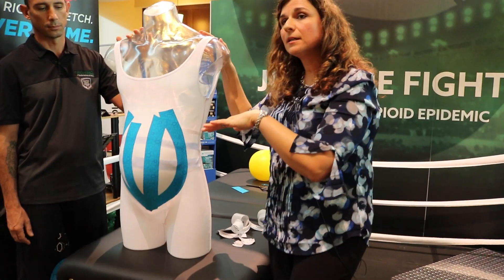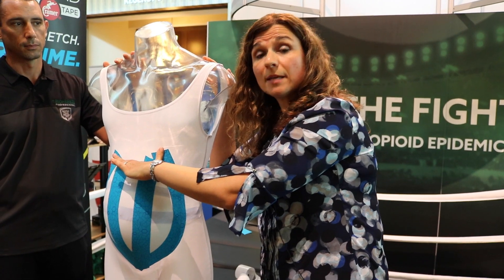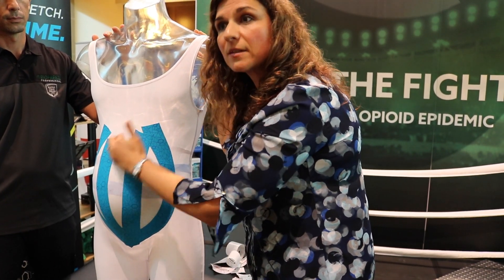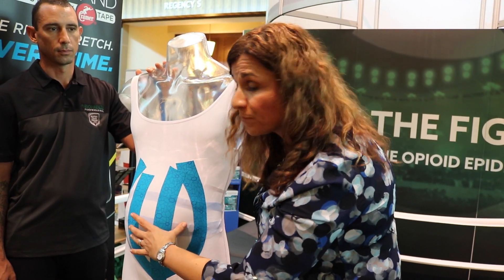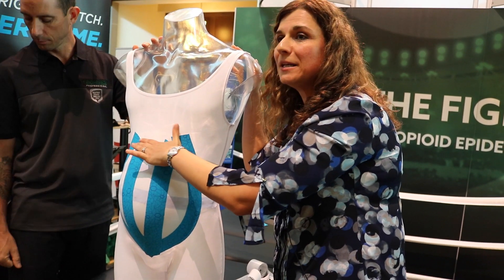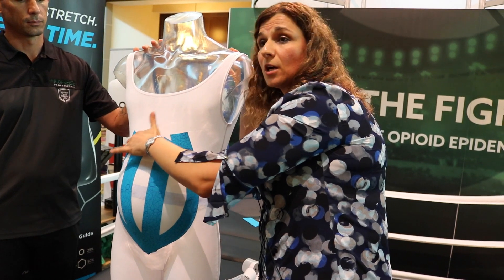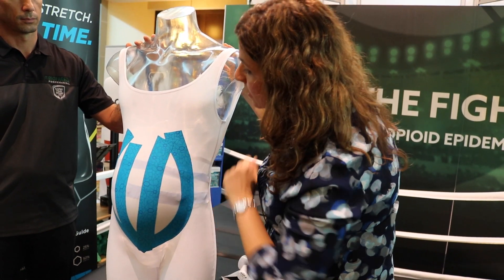Depending upon how mom is carrying baby — if baby is vertex or transverse — this may actually dictate the difference in how you're laying the midline of the tape, because the separation may be a little bit greater. Also, if baby's head hasn't flipped yet and is presenting up toward the ribs, mom has pressure from the ribs, so you may actually be taping over and closer to the intercostal spaces a little more than you would if baby is vertex. That's one important thing to consider.